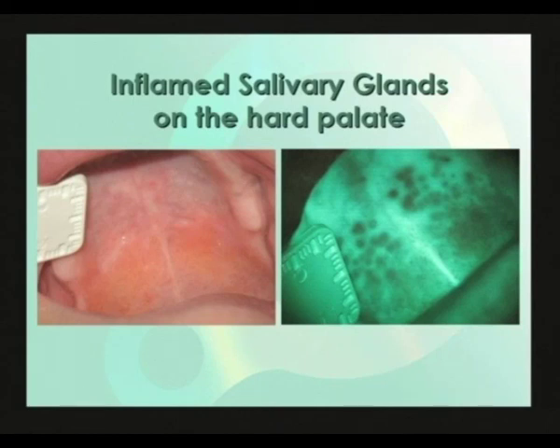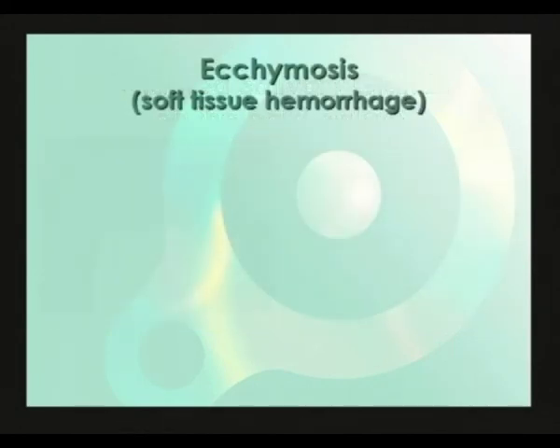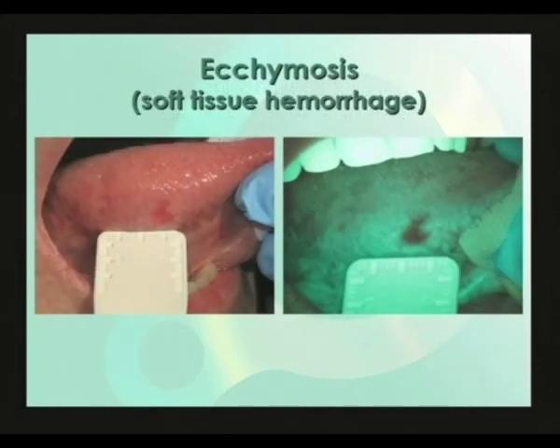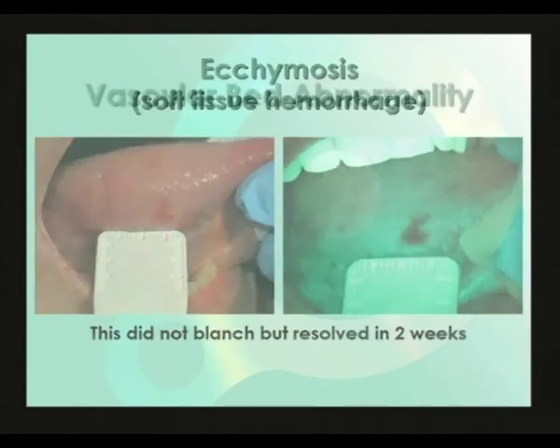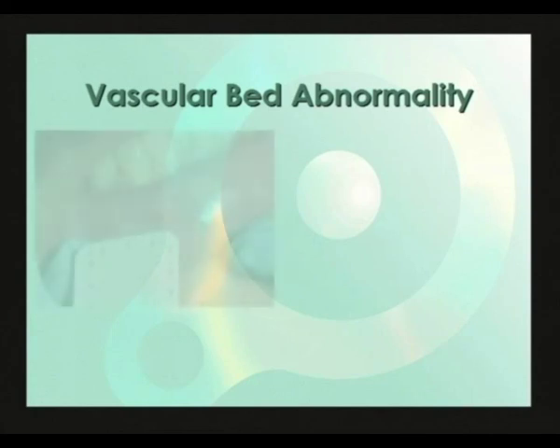The other theme in evidence here is to look carefully at the hard palate under white light again after observing it under VELscope — the inflammation is also quite apparent there. This is another example of an ecchymosis showing up dark under VELscope because of the localized blood, which did not blanch as in the earlier example. This lesion was gone at the two-week follow-up visit.